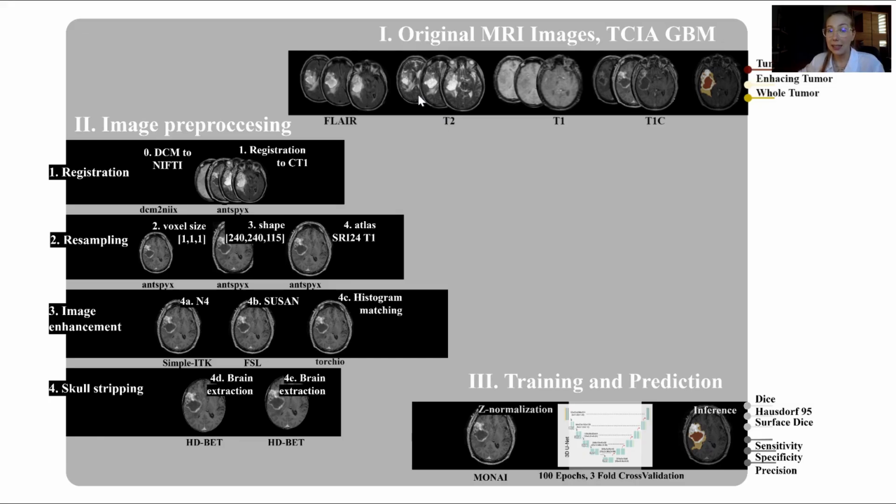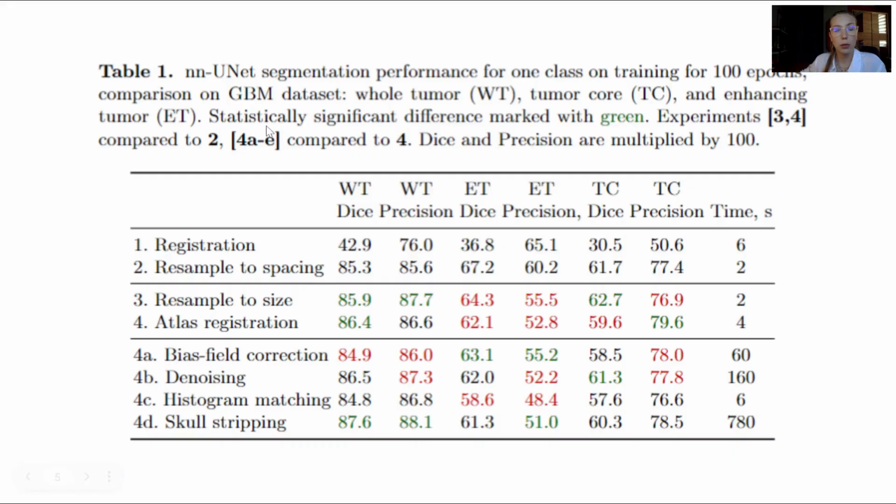We isolated all of these steps and performed an ablation study to see how each of these steps will be reflected in the segmentation quality of 3D nnU-Net. We fixed the number of epochs in cross-validation, and what do we get in the very end?